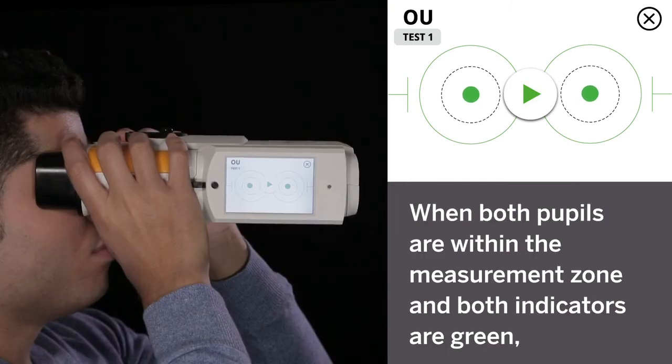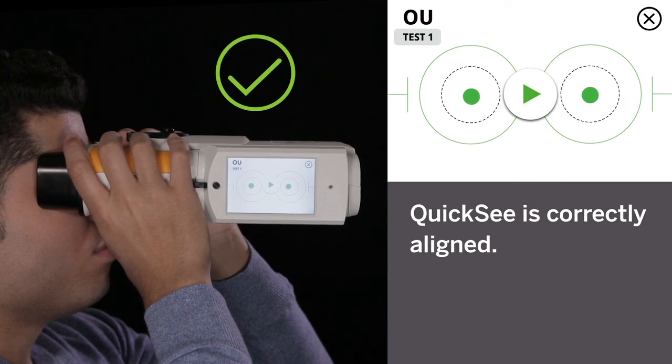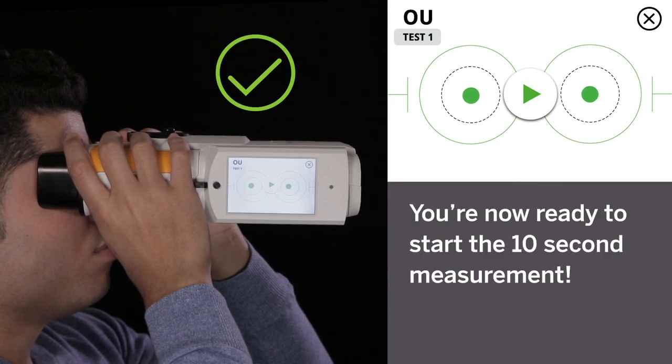When both pupils are within the measurement zone and both indicators are green, QuickSee is correctly aligned. You're now ready to start the 10-second measurement.